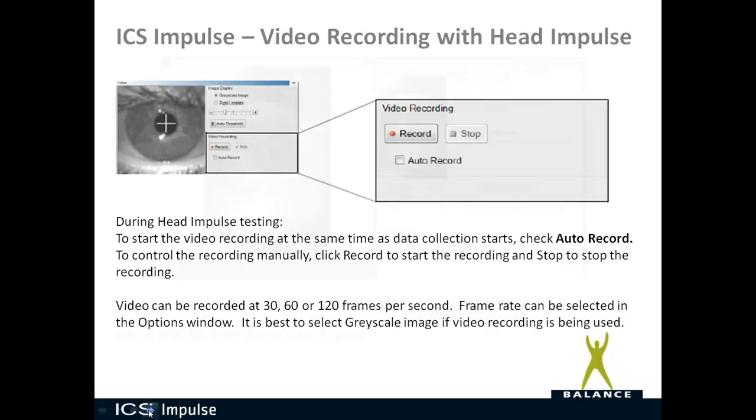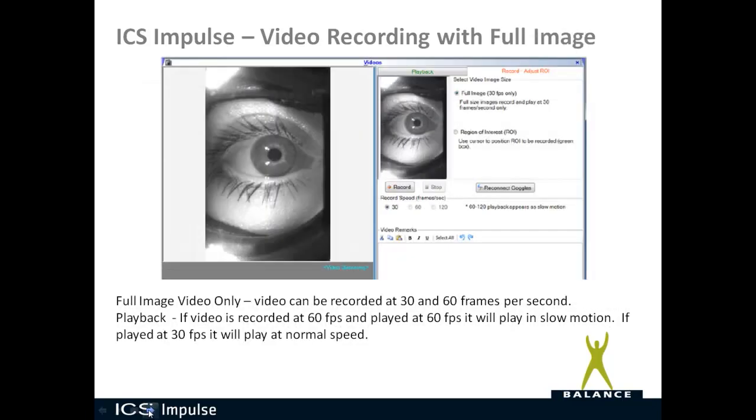Now you can also do video recording outside of head impulse in the video only mode, and you have two options for that type of video recording. You can record the full image or you can record a region of interest. For full image video only mode, the video can be recorded at 30 frames per second or 60 frames per second. For playback of this video, if the video is recorded at 60 frames per second and played back at 60 frames per second, it'll play in slow motion. If you play it back at 30 frames per second, it'll play at normal speed.